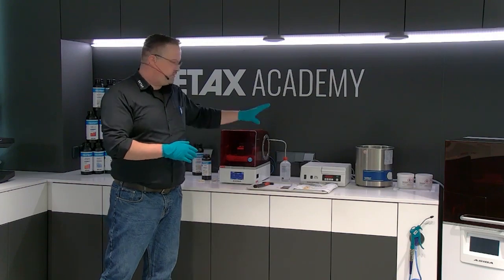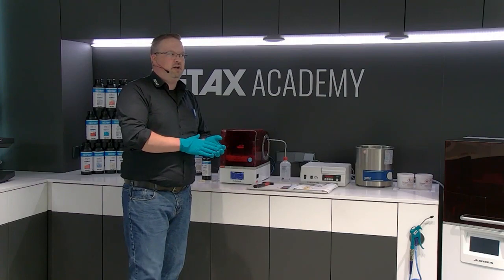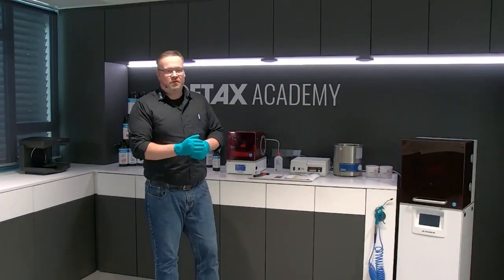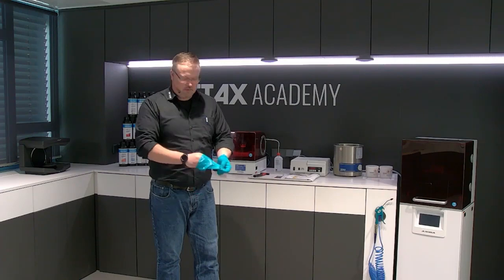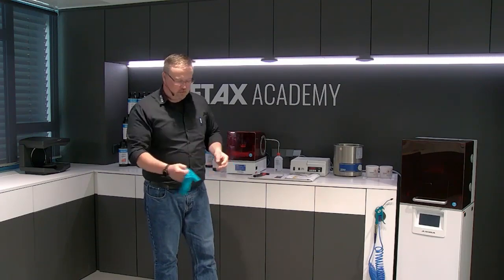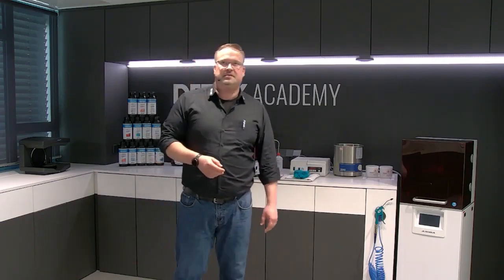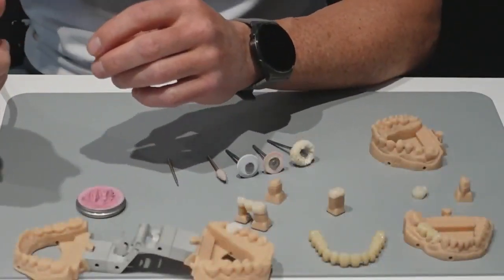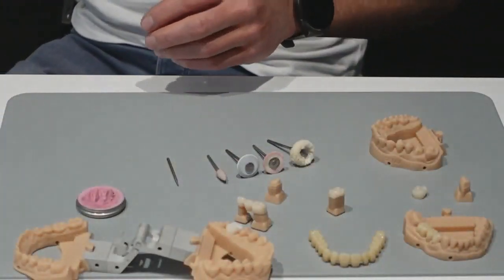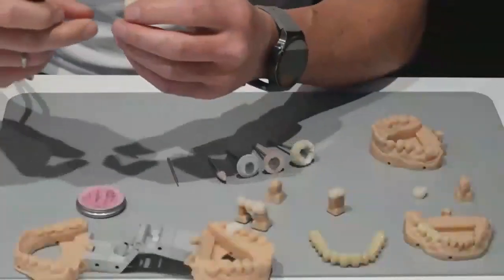The next step after curing, you can go to the finish step to finalize the crowns. For the finish step, I'm so happy that Markus will show you some parts, because we had also some questions about the polishing of the material, how it is possible to polish it. Markus, please show us a little bit about the finish, and we will see how easy it is to polish the parts. Okay, Marcus, I will do that. Thank you.